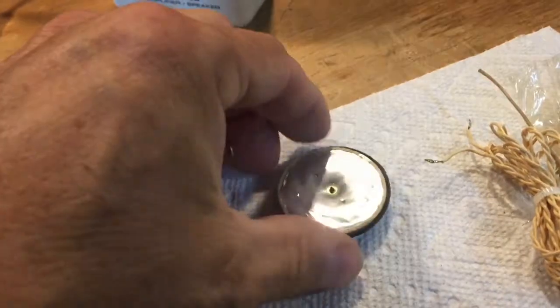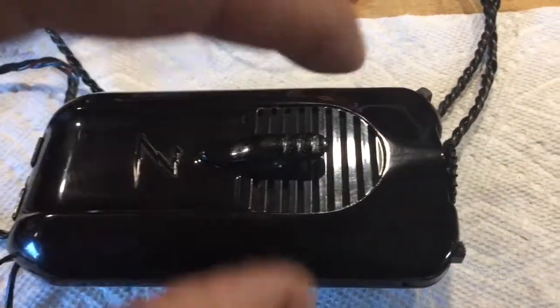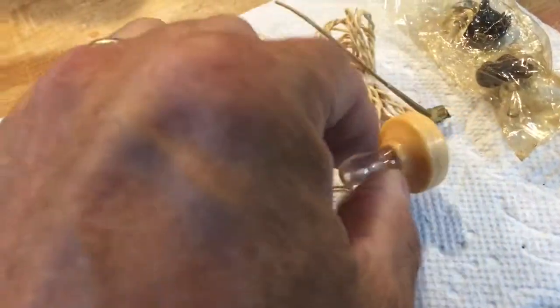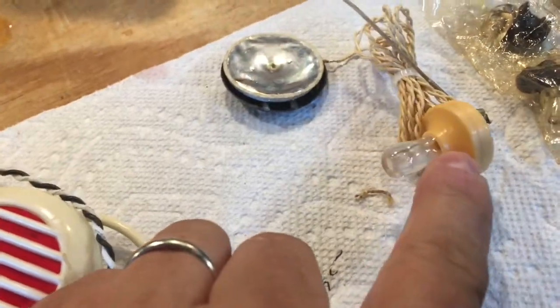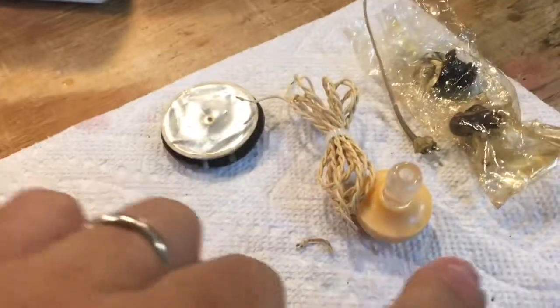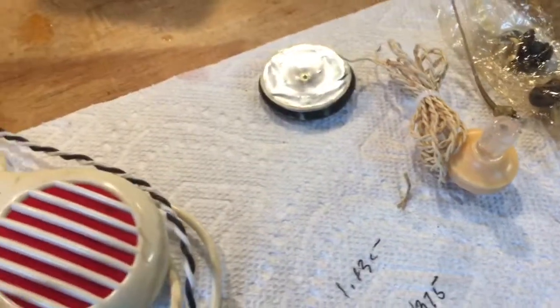What I discovered besides some bad capacitors was that this crystal microphone — I'm shaking it so you can hear — the element inside is damaged. So the microphone in the unit itself was unusable. Additionally, the earphone no longer works; it's also crystal and so it no longer works.